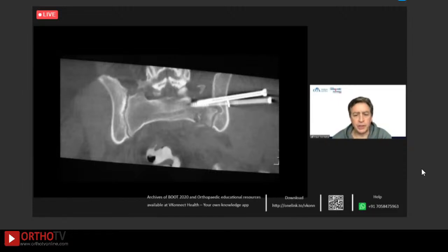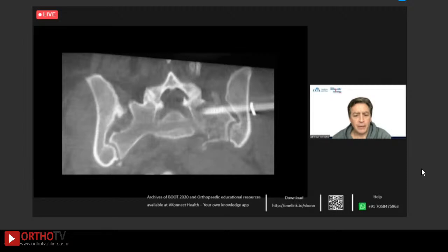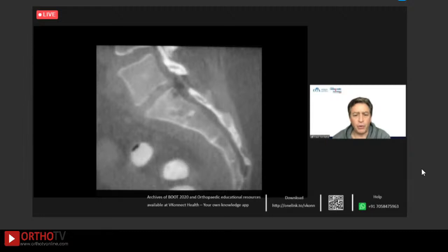But the CAT scan showed that the track that we had, fortuitously, because we went to the other ilium, I mean, the other side of the sacral ala, probably would suffice to go all the way across and grab the other side. And you can sort of see that on these cuts. And then here you can see the same thing on the sagittals, where those screws are going through in a relatively safe area to maybe go all the way across.